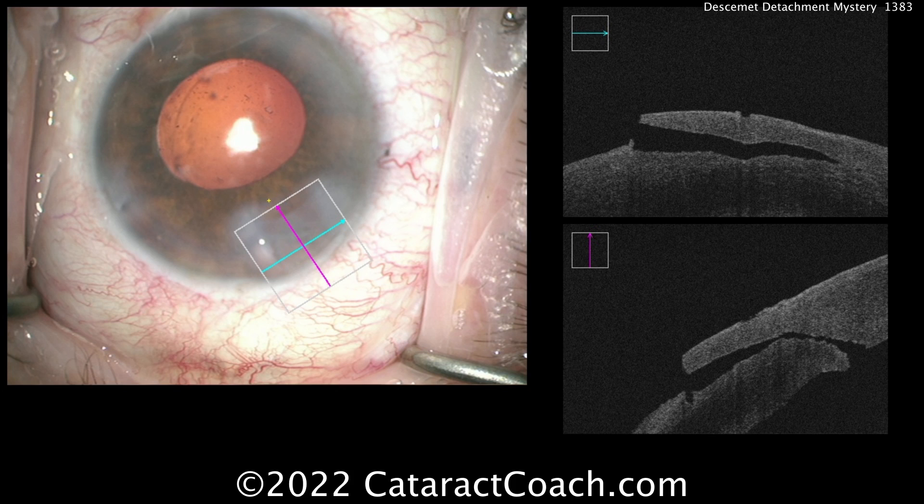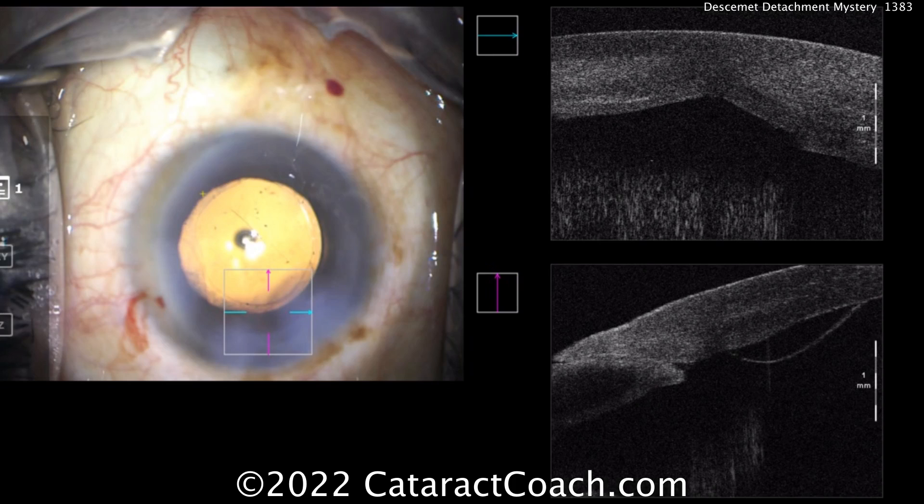After hydration of the incision it just wants to gape open — that's not an ideal incision. You don't know what you're missing until you look at the OCT image. Here's a Descemet's detachment where the incision looked okay, but going in and out of the eye with instruments you can inadvertently catch where Descemet's attaches at the very entrance point and push it off, causing this focal detachment. So the issue is the in-and-out of instruments through the incision — not so much the incision itself, which I thought was pretty good. Remember, even as an expert you will occasionally have a patient with a small focal Descemet's detachment. The key is to catch it early and make sure you don't let it extend.